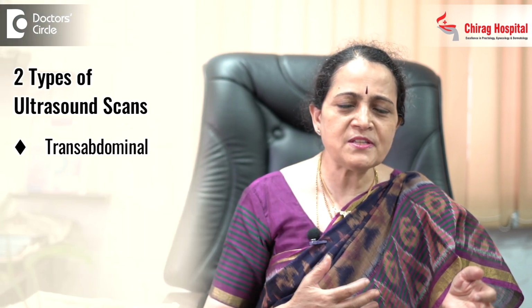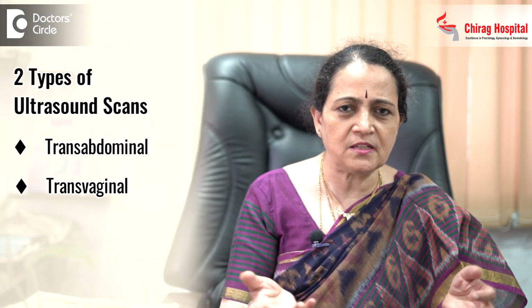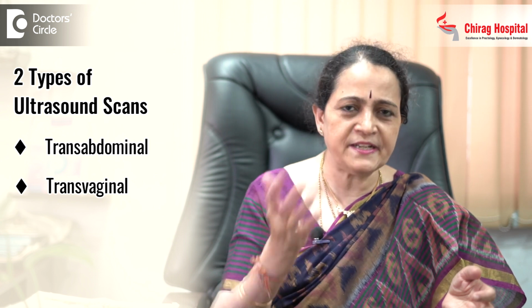Importance of transvaginal scan. As you all know, scanning is nothing but ultrasound scan, and in the ultrasound scan we have two types. One is transabdominal scan and the other is transvaginal scan. This comes more in ladies because our gynecological organs are in the pelvis, and the visualization depends on the probe of the ultrasound machine. So routinely, in an abdominal scan, we put the probe on the abdomen, whereas in a transvaginal scan, the probe is put into the vagina.